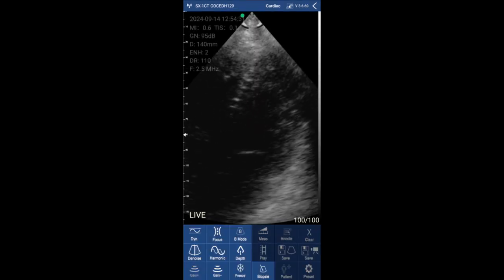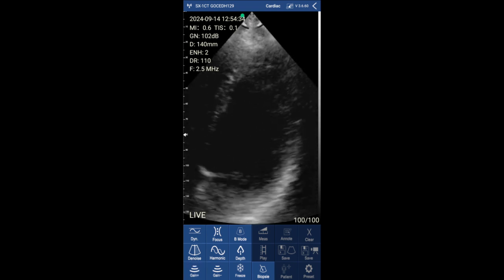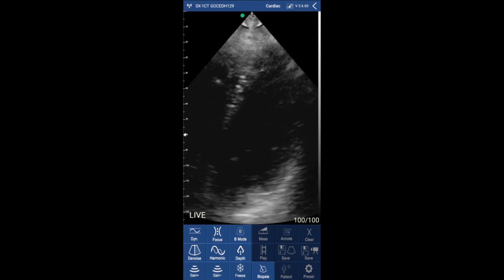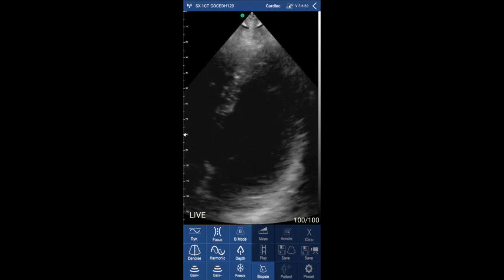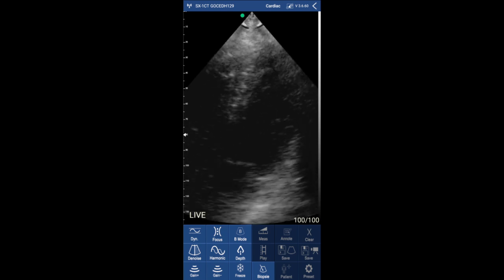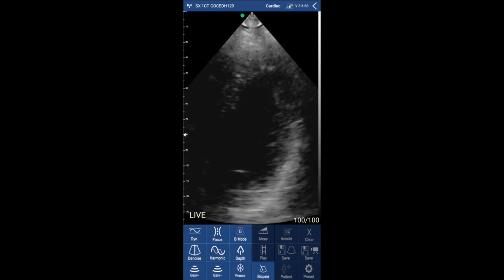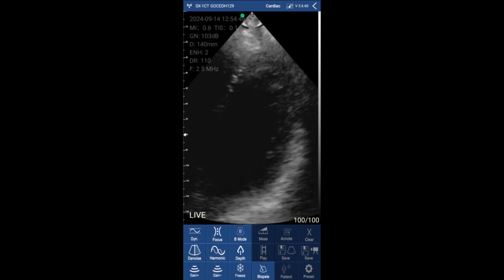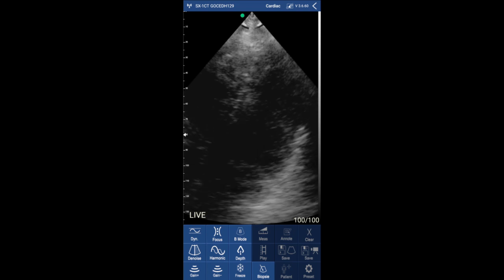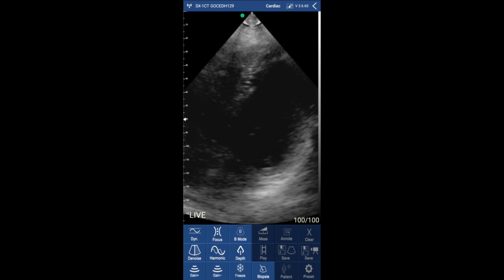This is a focused LV view from the apical four chamber view. The image quality is very nice — you can clearly see the mitral valve. You can also increase and decrease the depth. Even though it's a portable device, you have loads of tools you can use to go the extra mile with your analysis.